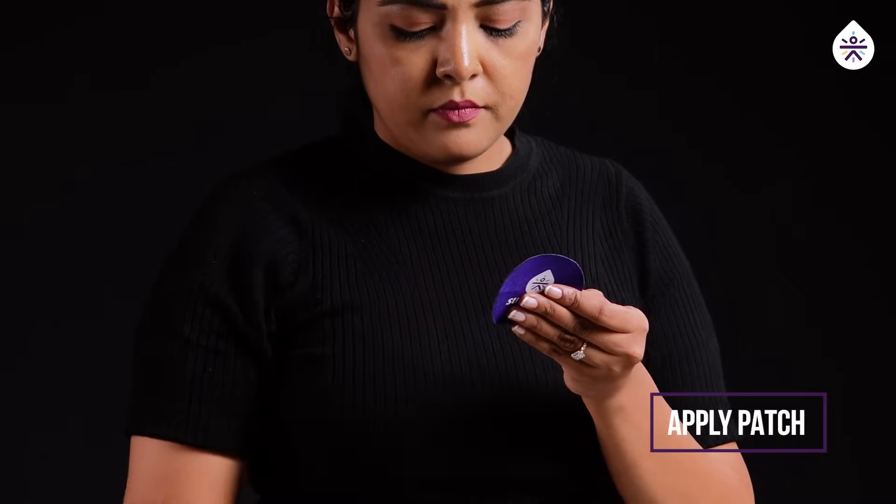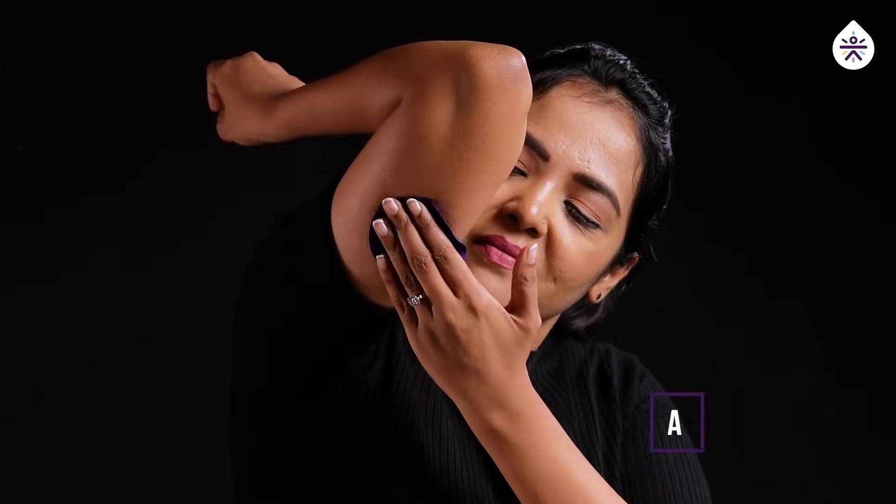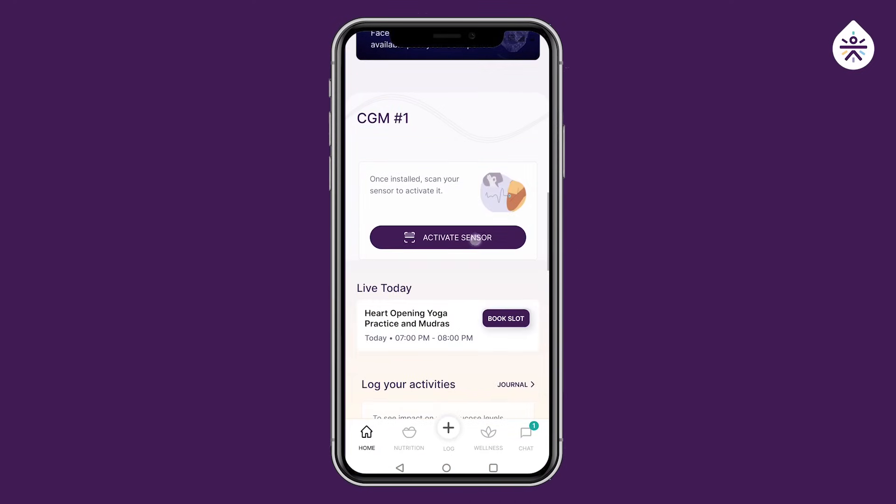Now peel off the sticker of the SugarFit patch and apply it on the sensor. Open the SugarFit app and scroll down. Click on the activate sensor option.